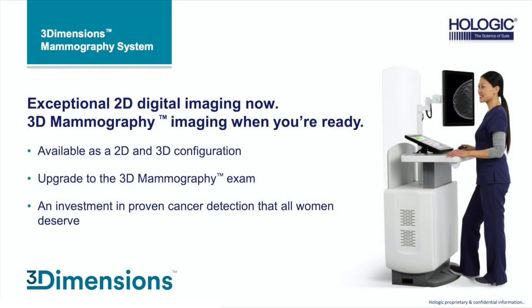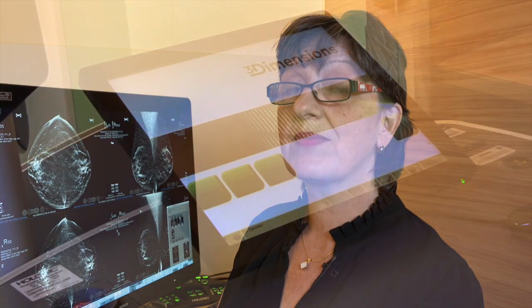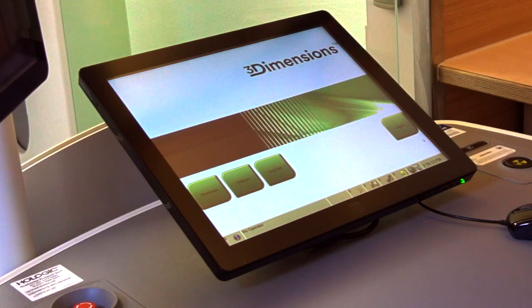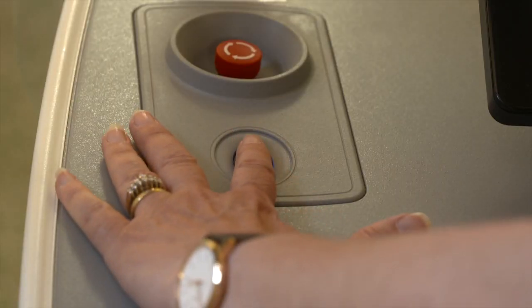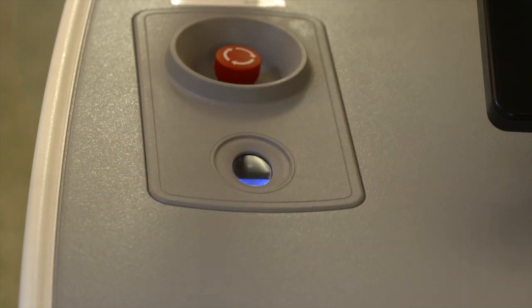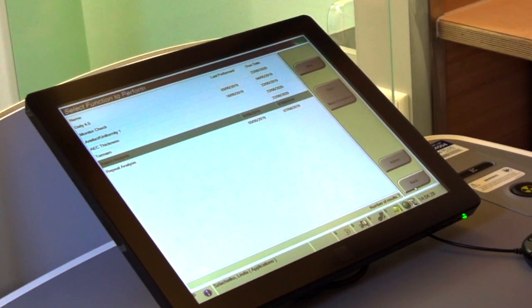This is the Hologic acquisition workstation and it only takes a few minutes from switching on to logging in. Once we get to this page we can log in using biometric login. It's very simple and easy and as you can see the console moves at the same time. This is programmed in at the time of applications for each mammographer.